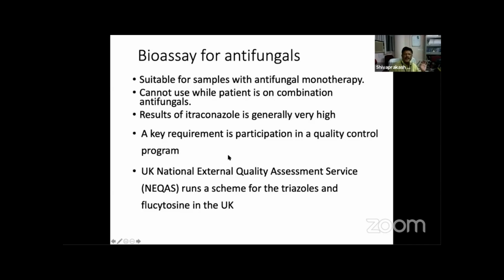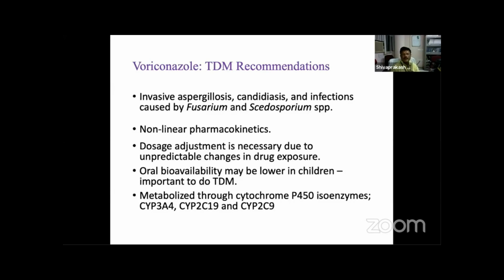As I have already told you about quality control, it is very, very important. You have to participate in quality assessment. Now certain recommendations, for example, the voriconazole TDM recommendation. Generally you do it for voriconazole, which is given mainly for aspergillosis and many other infections. Its pharmacokinetics is non-linear, and dosage adjustment is necessary.